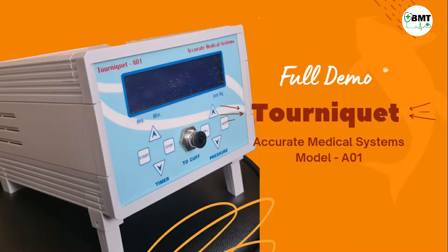Hello friends, today we will be learning about the tourniquet machine. A tourniquet is a device that is placed around a bleeding arm or leg. It works by squeezing large blood vessels, and the squeezing helps to stop the blood loss.